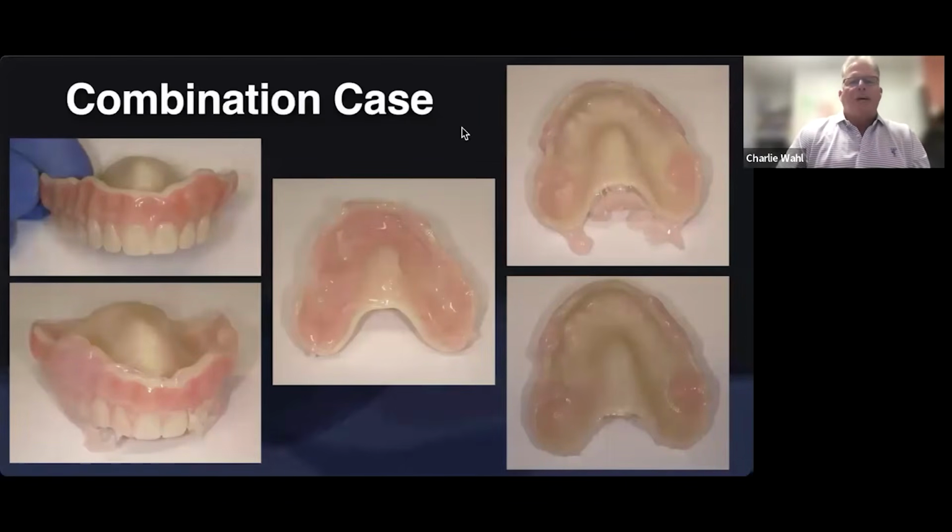Some are easier than others. And we finally got to a point where we're like, okay, we're ready to think about making our final restorations. One of the challenges of printed materials is it's more on the resin side, kind of like an acrylic, and not a whole lot of materials, relines, rebases stick to digital dentures, especially the early ones. We're getting a lot better, but it's still probably one of the limitations of printed materials.